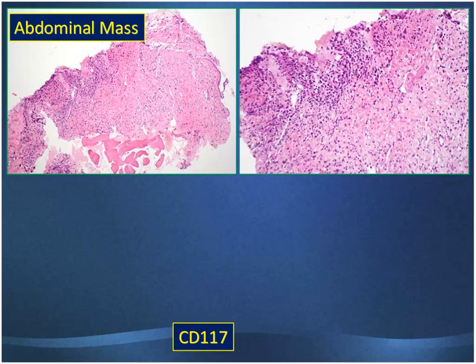And on the top part of it, one can see areas which look like clusters of cells, and these clusters of cells could be anything from lymphoreticular cells to carcinoma cells to sarcoma cells, etc.